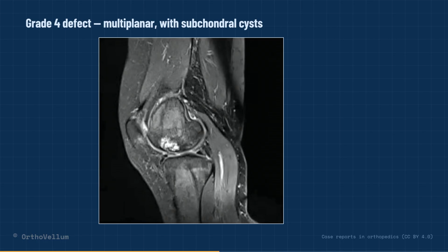Full thickness loss with exposed subchondral bone, secondary sclerosis, cyst formation, osteophytes. Document it as the report demands: AP dimension, width, and depth in millimeters, because size determines treatment. And the planning lesson the figure carries: treatment must address the whole osteochondral unit, bone and cartilage, not cartilage alone.